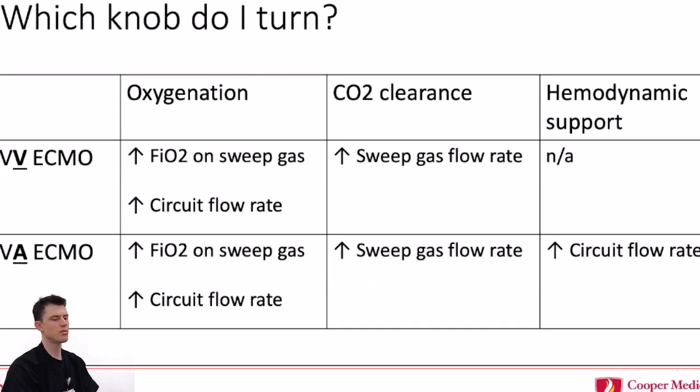It all comes down to the patient. One thing that I've thought a lot about and I think has helped some is trying to get the PCO2 level on the ABG a little bit more normal, in order to help wake people up so they don't have that drive to breathe. But it depends on the particular patient and the chronicity of that PCO2 being so high.